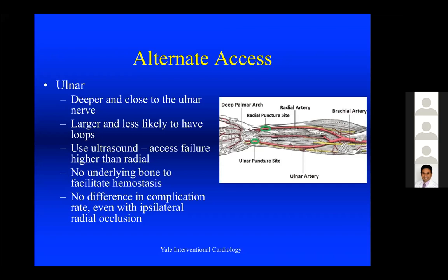And so I would encourage everybody to use ultrasound if you're going to do ulnar access, because it's a little harder to feel the pulse and to stick it directly. Also, there's not as much underlying bone. It's not directly over the bone. And so hemostasis does require a little bit more aggressive pressure to really get it compressed.